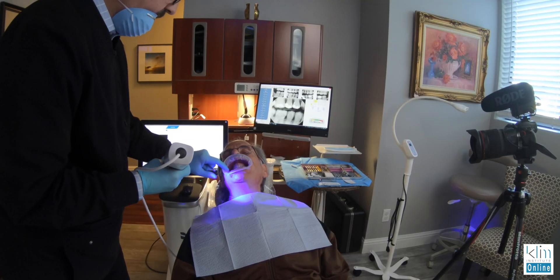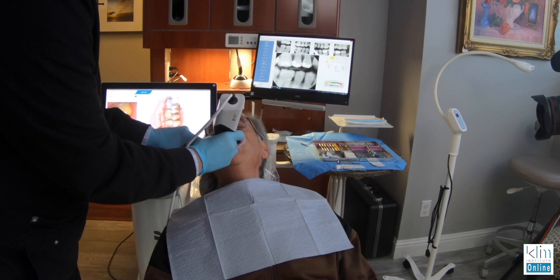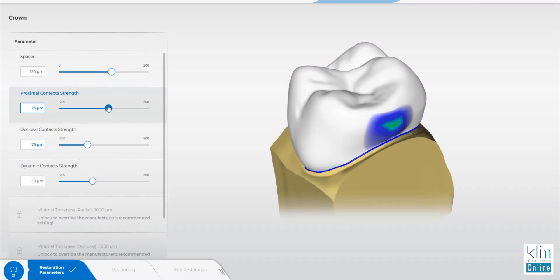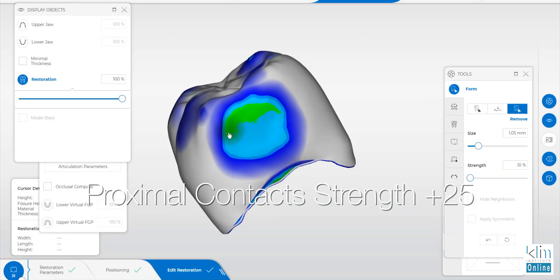This is my basic workflow with Katana, particularly on a second molar: take the bite before you numb the tooth up. This is such a routine flow with Katana — I find that we have it down, particularly with the Prime Scan and the Prime Mill going into the Speed Fire.